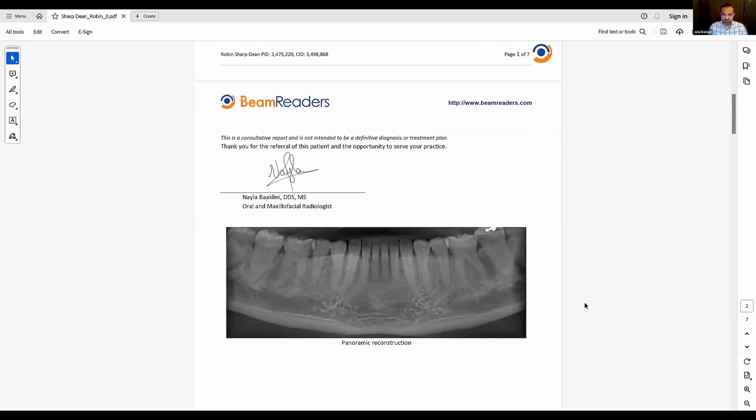I definitely agree. It's very important to remember that there's so much that we can deduce on radiographic interpretation. I think it goes hand in hand with clinical information. You can't do one without the other. But if we find something radiographically, it's important to correlate it clinically as well, so we can come to a diagnosis. Absolutely, I agree.